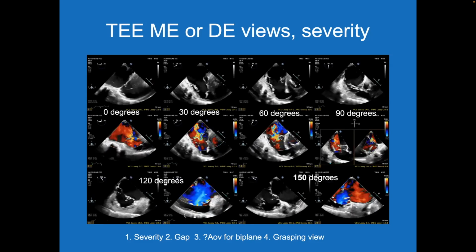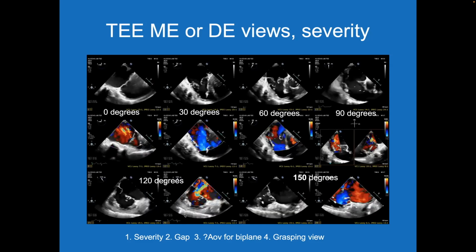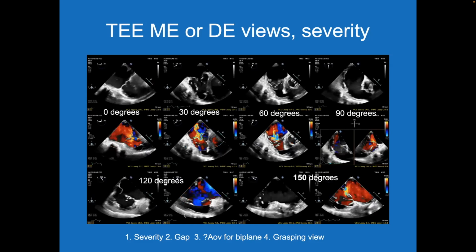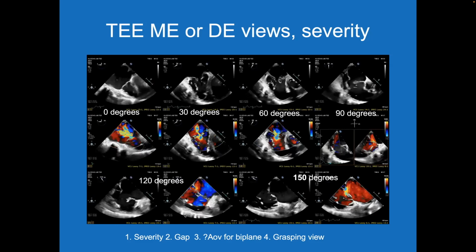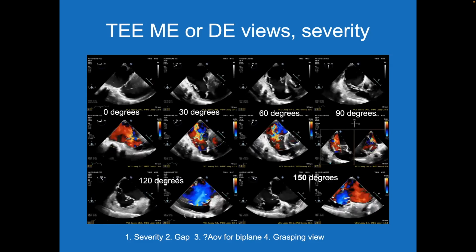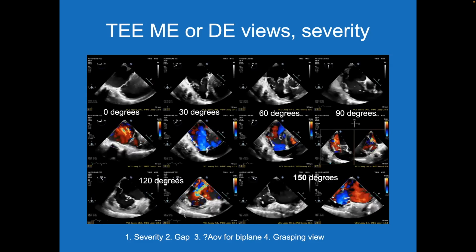the system's in there. So again, you can see in the top left-hand screen how bright the tricuspid valve is compared to what you normally see in a normal mid-esophageal view, because you're not having the image through the aortic valve, annulus, or any part of the annulus there, because it's gone, because you're pushed all the way in and really have the coronary sinus there. So that leads to a lot of good multiplanar reconstruction views, and also gets you a lot of times around the system that's in the right atrium when you can't see.